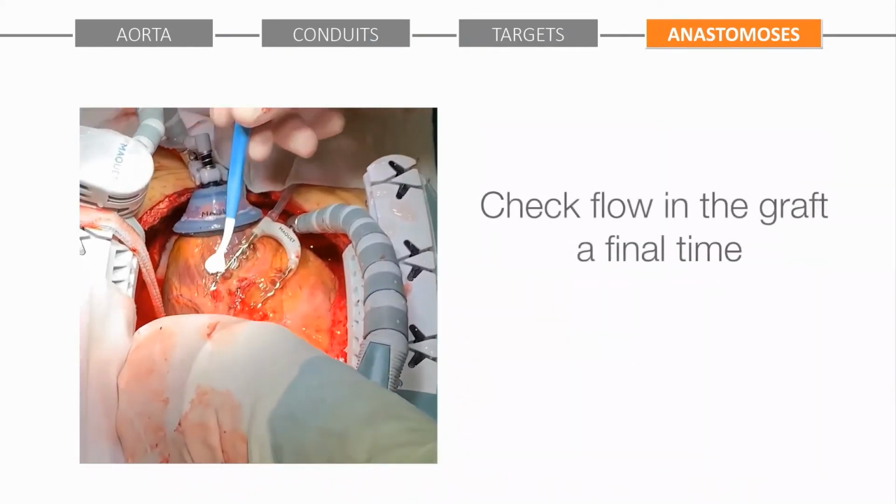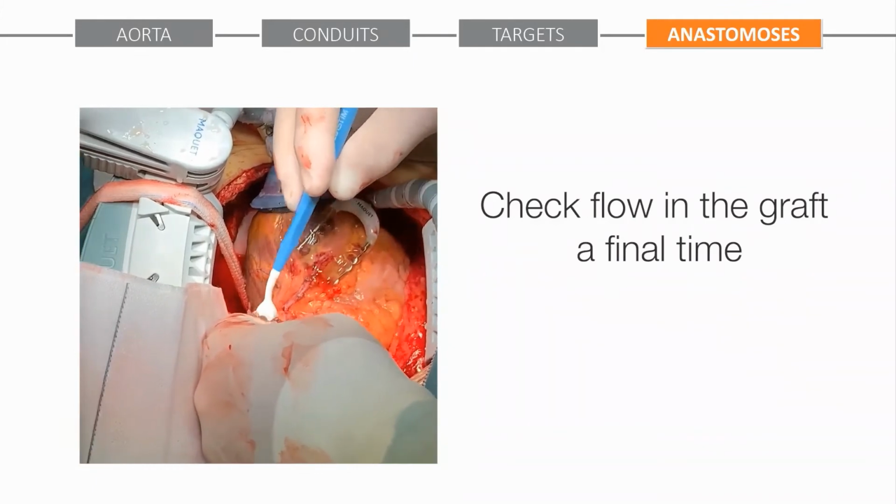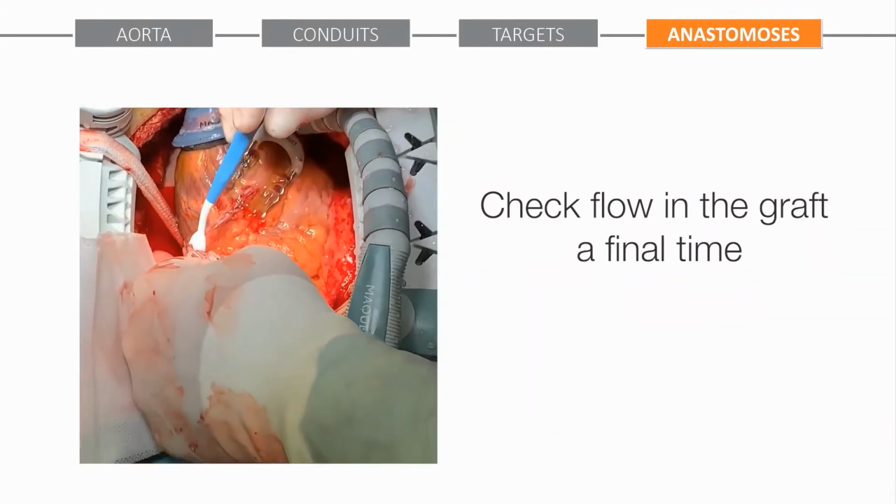To ensure there are no kinks or stretched conduits, it is recommended to check graft flow a final time before chest closure.